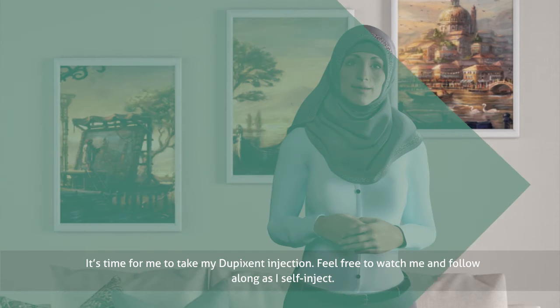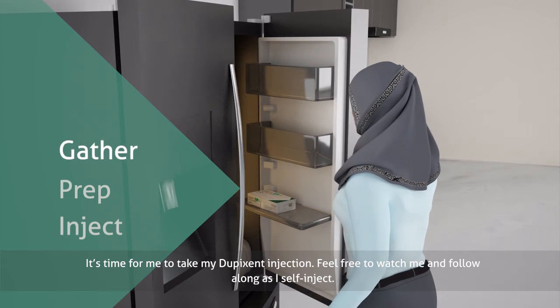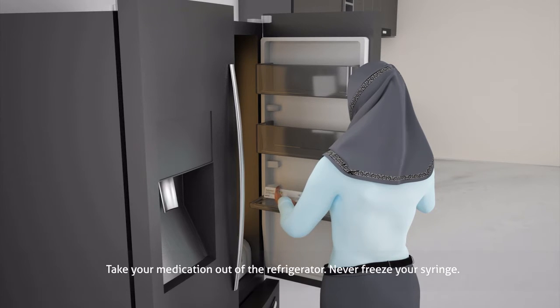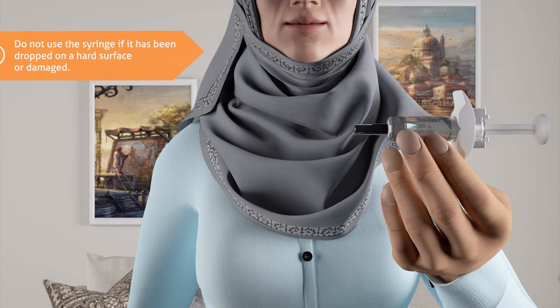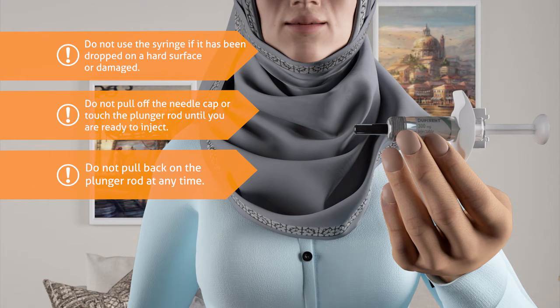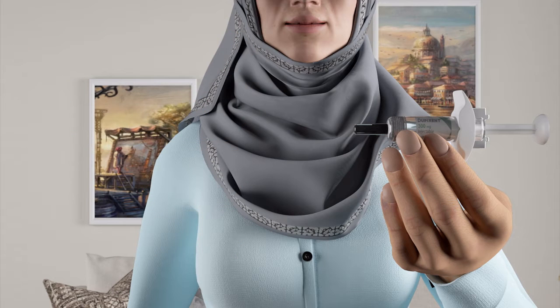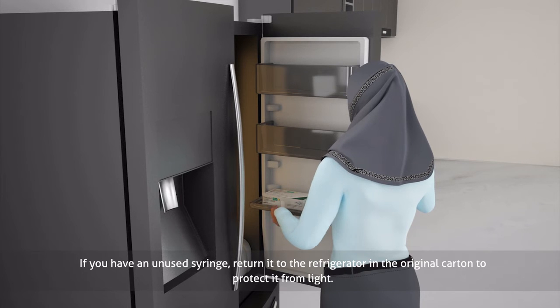It's time for me to take my Dupixent injection. Feel free to watch me and follow along as I self-inject. Take your medication out of the refrigerator. Never freeze your syringe. Remove the syringe by holding the middle of the syringe body. Do not use the syringe if it has been dropped on a hard surface or damaged. Do not pull off the needle cap or touch the plunger rod until you are ready to inject. Do not pull back on the plunger rod at any time. Keep Dupixent syringes and all medicines out of the reach of children. If you have an unused syringe, return it to the refrigerator in the original carton to protect it from light.